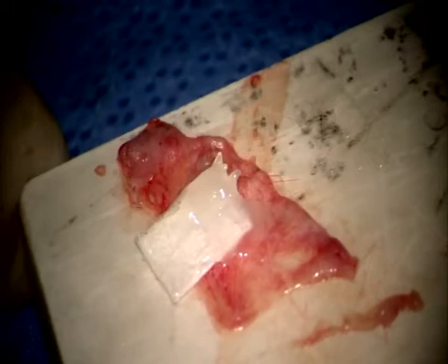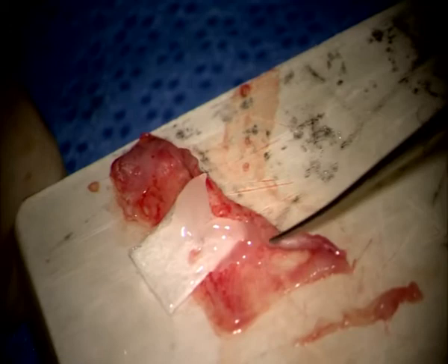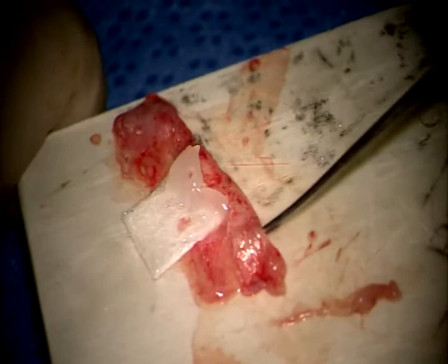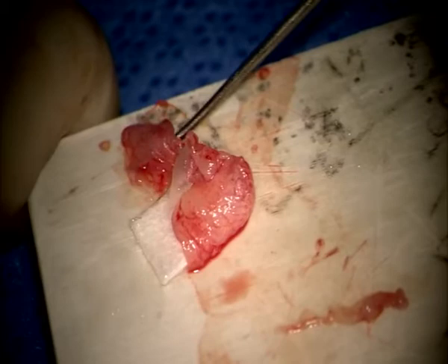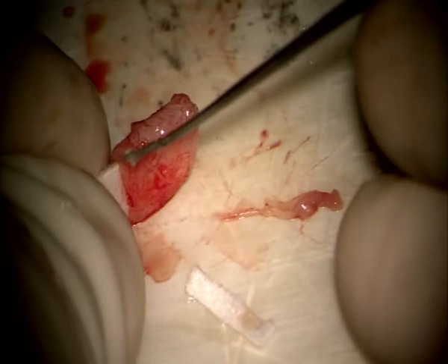So fold the skin over, and then another fold like this, and another. This is a big skin. And then turn it to the side so I could pick it up. So this is basically a way of making sure that it's easy to introduce.